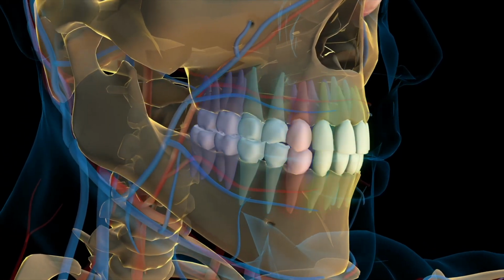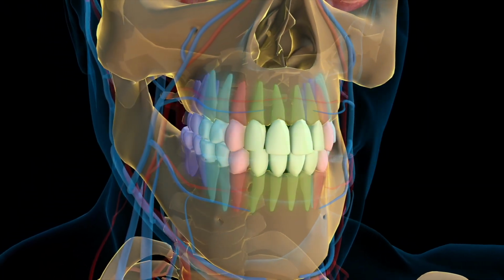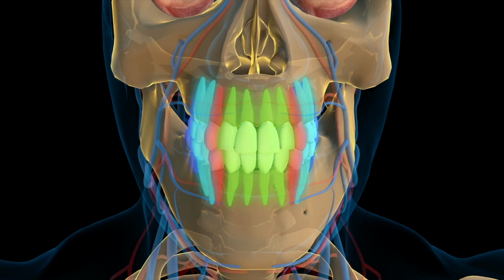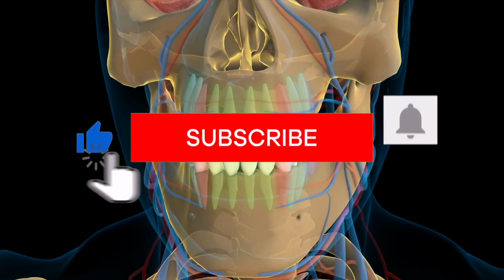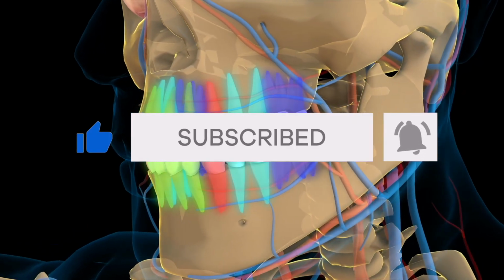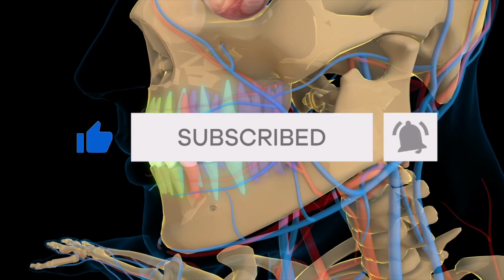For patients with gum disease or deep pockets around the teeth, a procedure called scaling and root planing is performed. This deep cleaning goes beneath the gum line, and chemical irrigants are used to flush out bacteria and toxins from these hard-to-reach areas. These solutions help reduce inflammation and promote healing of the gum tissue.